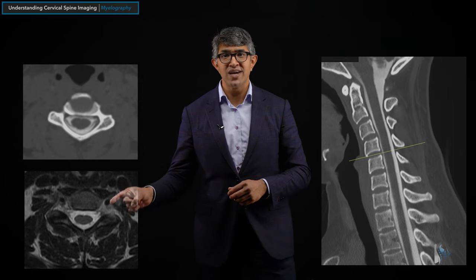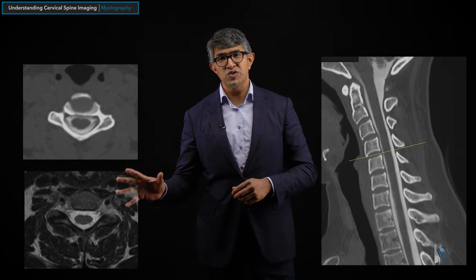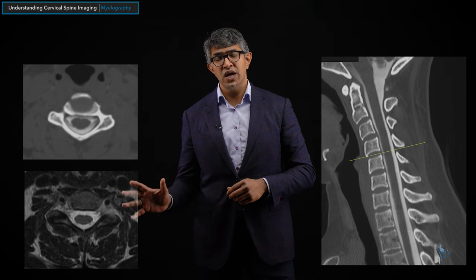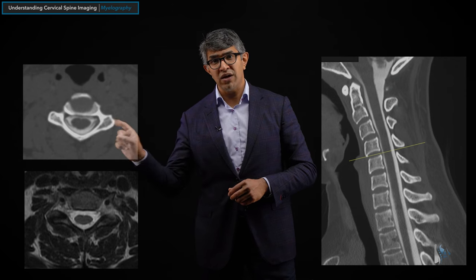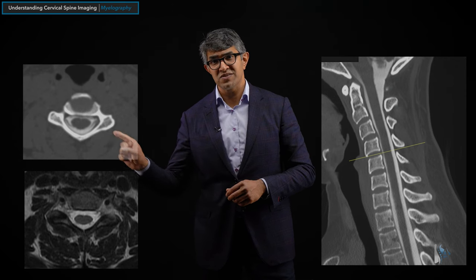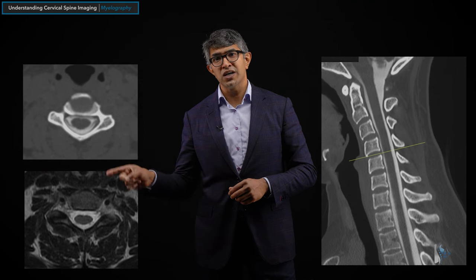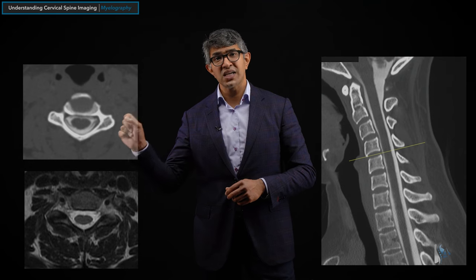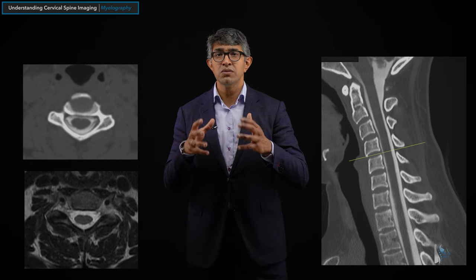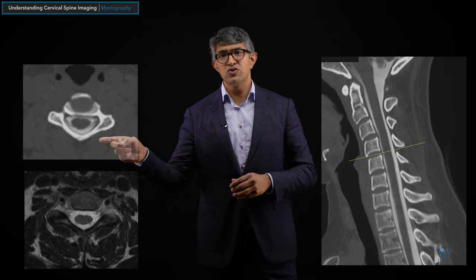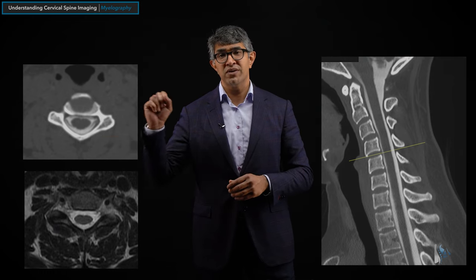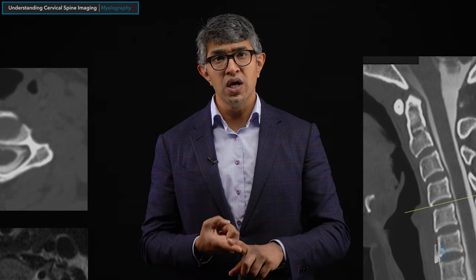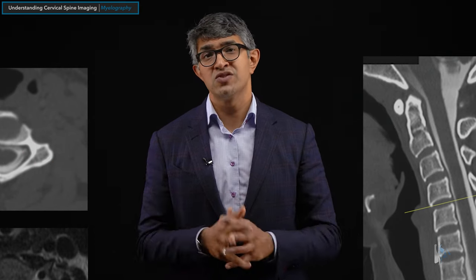By comparison, if you pull up an MRI scan through the same level, you can see a comparison between a CT myelogram axial image and an MRI axial image. Both show you the outline of the spinal cord, the CSF space, and even the little rootlets. On CT myelogram you can see the foramen and surrounding structures, but the contrast does not get into that space — it stays limited to the thecal sac surrounding the spinal cord. So you lose some ability to resolve what's happening further out. But a CT myelogram is a very valuable study to look at the spinal cord and spinal nerves when an MRI is not an option.